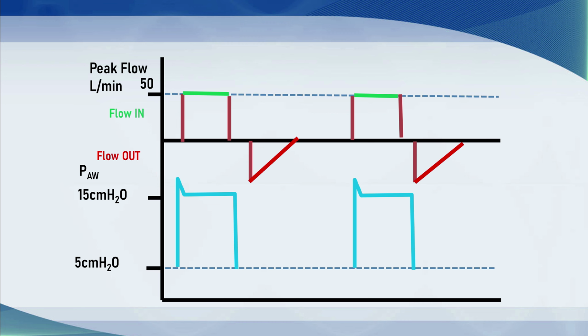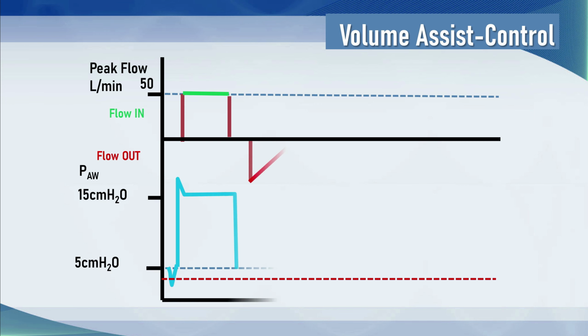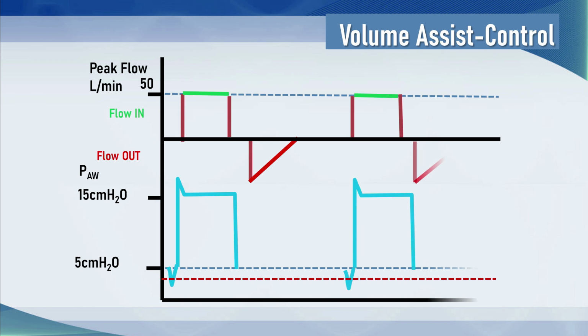Just to revisit a couple of things here, we're going to just talk about triggering. Here we have an unassisted volume controlled breath with an inspiratory pause, but there's no assistance here. So when you see this, you know that this must be time triggered. The other thing that's worth a thought on this particular case, you can see here, this looks very like the picture I showed you a few minutes ago.